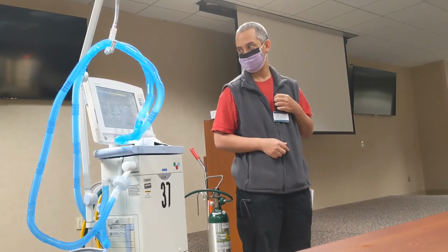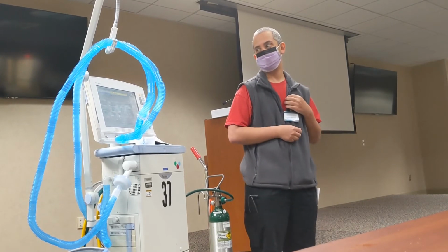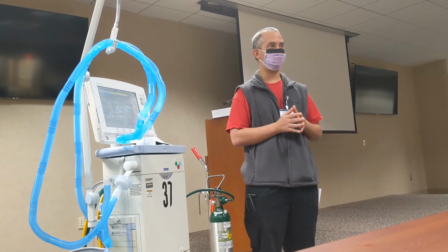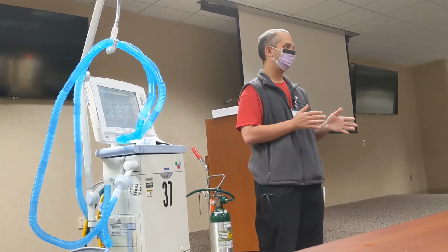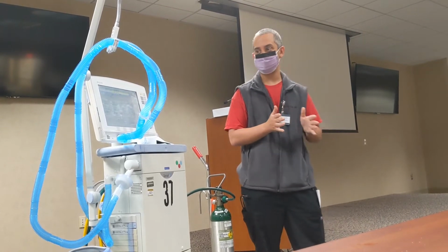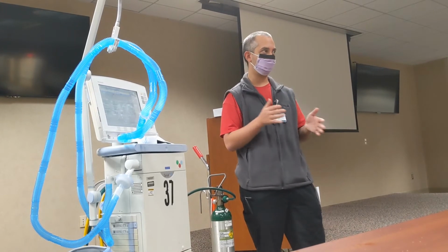And then your T high is the last one, and that's mainly the one you're going to play with when you need more ventilation, because basically by setting your T high higher or lower, that's adjusting your respiratory rate.